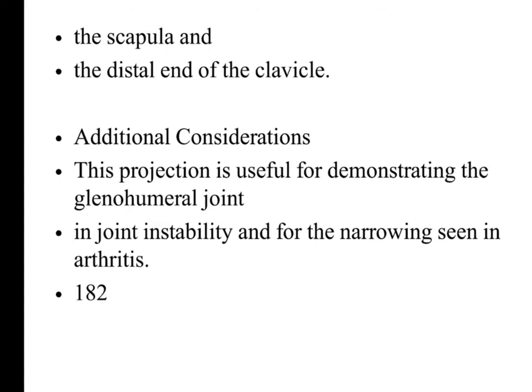Additional considerations. The projection is useful for demonstrating the glenohumeral joint, joint instability, and the narrowing seen in arthritis.